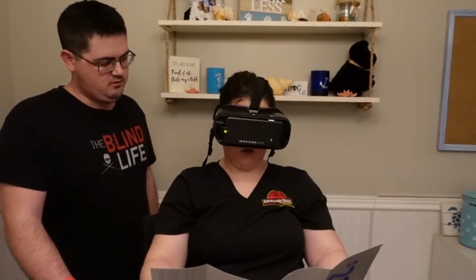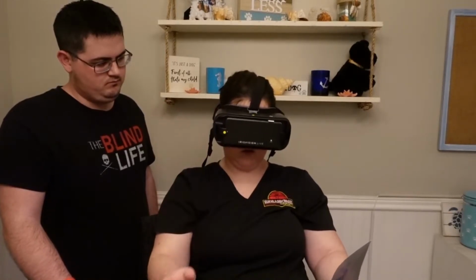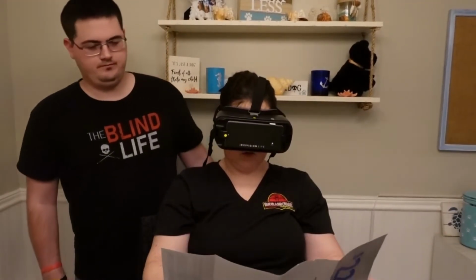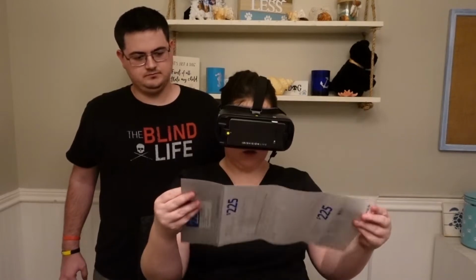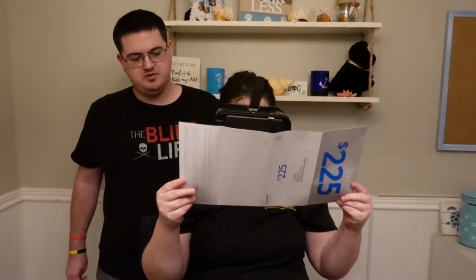Okay. Go ahead and press that button. Reading inverted. Reading inverted, black background, white text, which is so much better for RP. But unfortunately, that junk mail has very tiny text. But maybe we can magnify and enlarge the text.